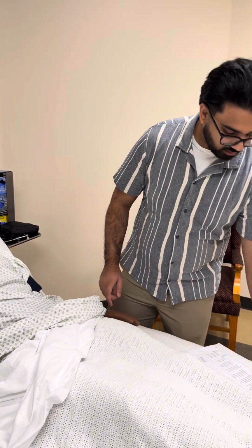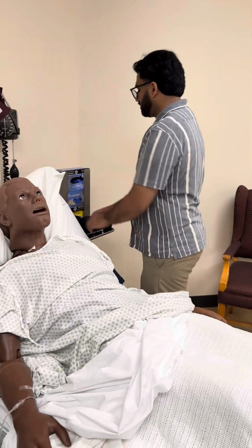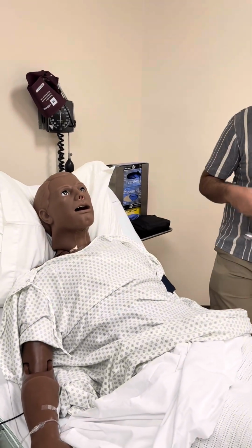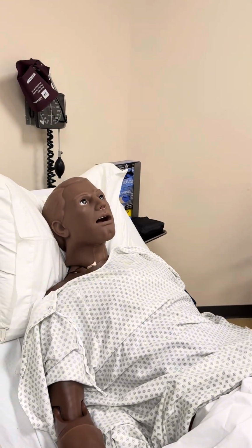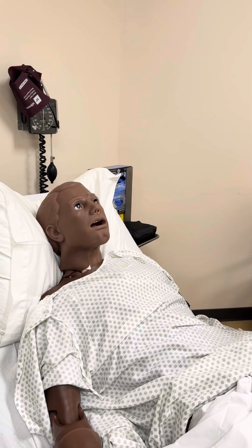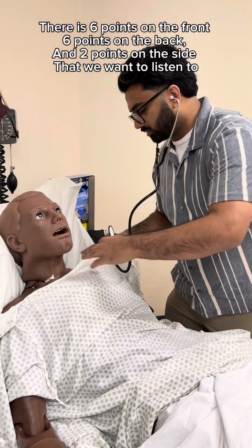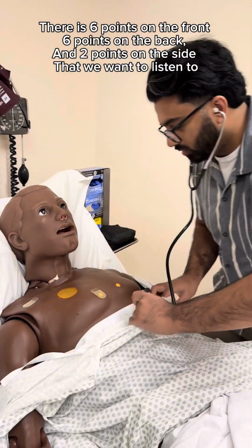Lastly, I'll be using a stethoscope to listen for clear breath sounds, and I will be demonstrating the points for that. So once again, I will be having to remove my patient's gown. So I'll start from the top once I have let them know.